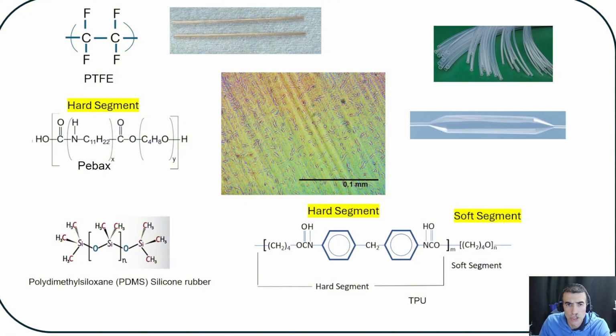And basically you change the durometer of the polymer. So you can go softer, you can go harder, changing the ratio between soft and hard segment, and you can generate a lot of different properties. For example, polycarbonate-based or polysiloxane-based polyurethanes are more resistant to chemical environment. That's why they are more suitable for implant application. They are stronger. Polyether is more flexible. They have different properties when compared side by side.